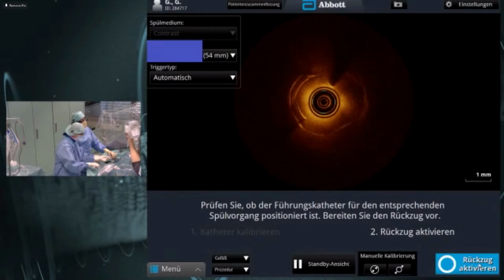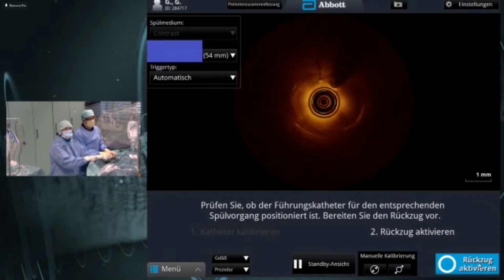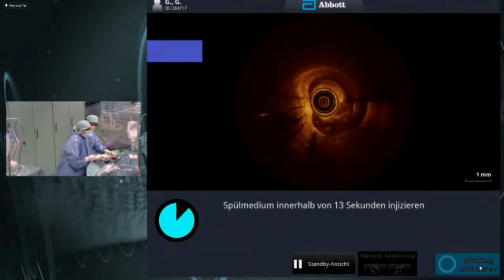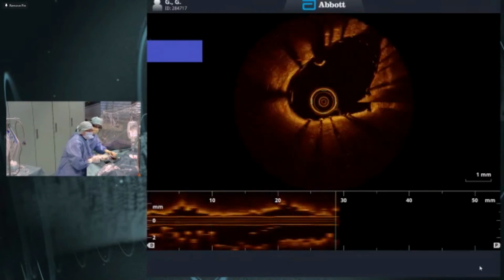And then we will follow up the patient clinically in the next 6 months regarding the LAD. If we need some LAD PCI there, the stent is endothelialized, and we can also go with a 1.25 rotablator burr down there. So I think this is not a big risk. Okay, so we are prepared, and tell me when. Okay, you can push, yeah. Well, okay, great.